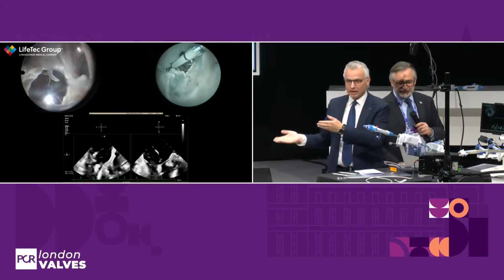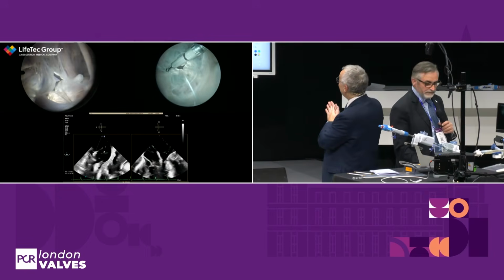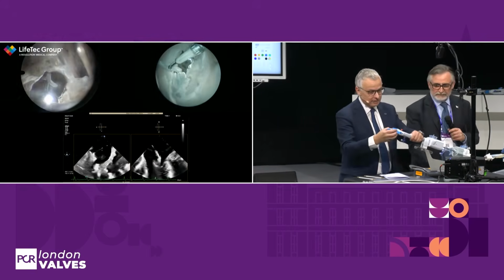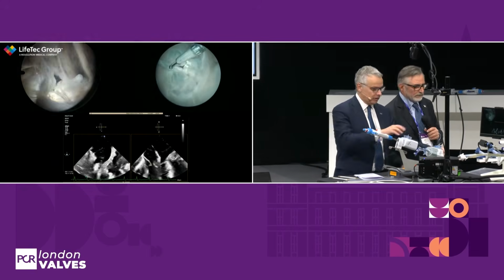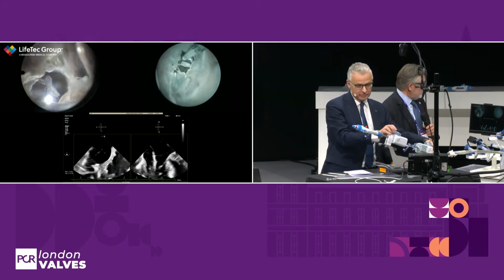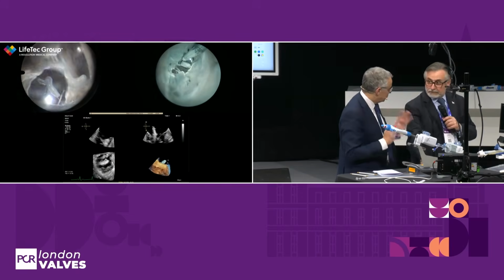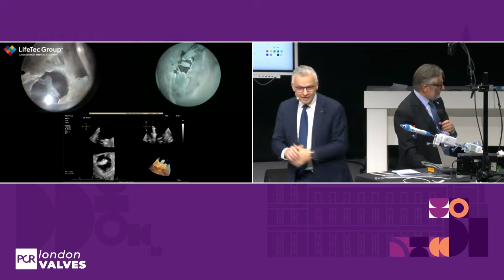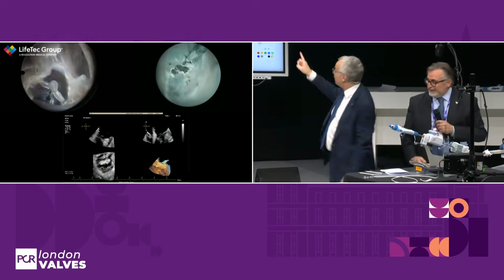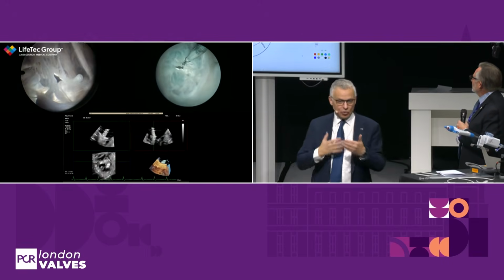Now let's simulate the other option to go into the posterior anatomy. Look where the target is. So we can try to go there. If we want to go into the posterior anatomy, which is this one, you agree on the orientation more or less? Yes. If we go there, if you look below the leaflets, you see the complexity of chordal distribution.